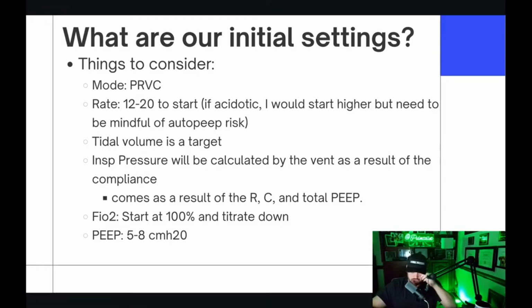And if you don't believe me, you can go to a ventilator sim and do it and see what the peak is. If you have constant flow, because there's always a contribution from the resistive portion of the pressure to the peak airway pressure, your peak airway pressure is always going to be a little bit higher, because you always have flow. But that doesn't mean anything. A difference of 4 centimeters of water in peak airway pressure doesn't do anything. It doesn't decrease mortality. It doesn't do anything, right?